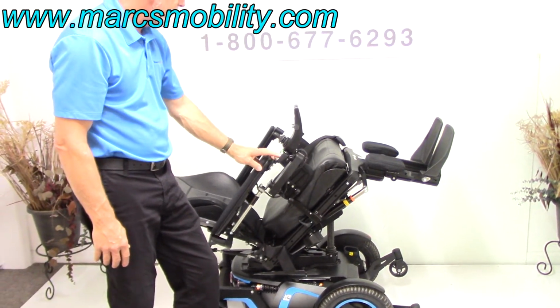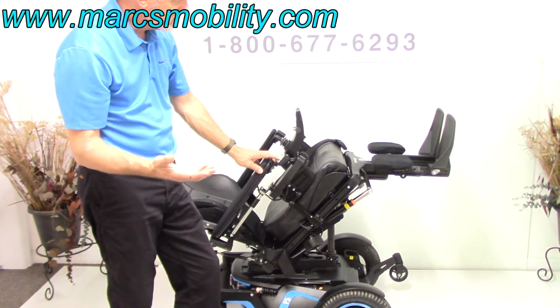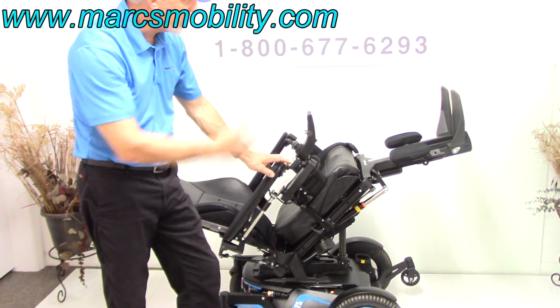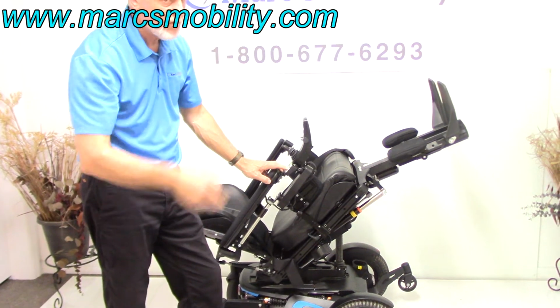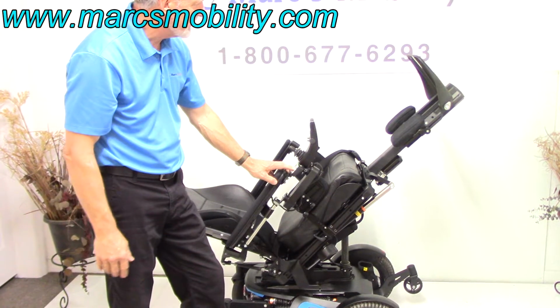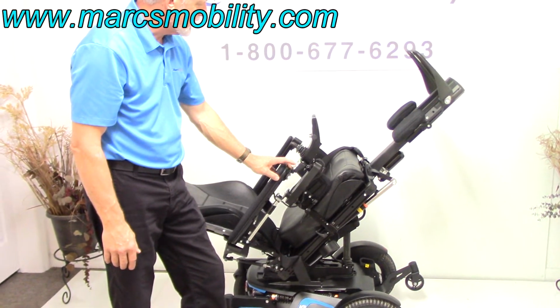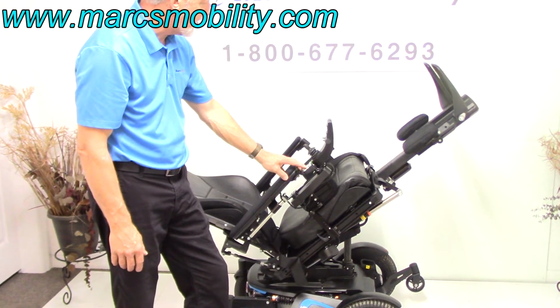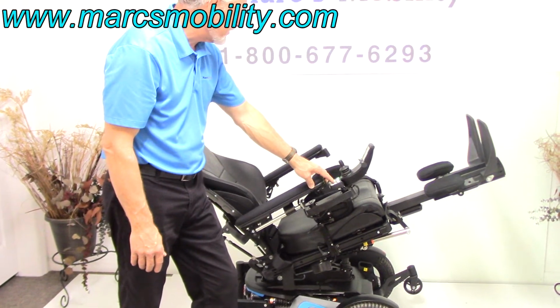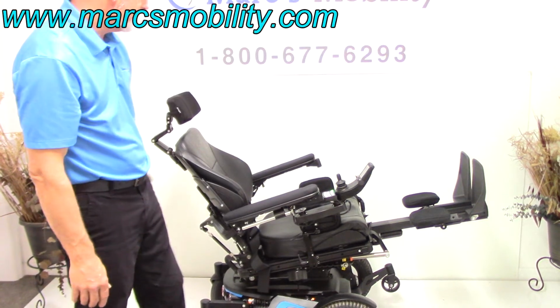The next thing I want to do is the legs. So if you wanted good circulation, this would be an extreme way of doing it, but you could raise your legs up. You definitely would have your legs above your body, but as I said, that's extreme, but I just want to show you how it can be done. Okay? So probably what you would do is you would do your tilt, maybe not quite that far, maybe only halfway. You'd still be able to get circulation in your legs if you were probably right here. You'd still be pretty much tilted enough for circulation.